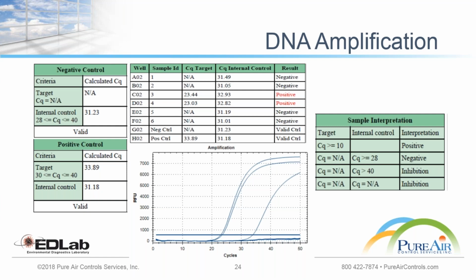Yeah, and I know that here in our laboratory, Dr. Sahay, we do perform all three of these different methods that you just went over. And it's pretty impressive to see the way the technology has evolved over time, especially for this DNA amplification, using PCR, the polymerase chain reaction. You can get these different types of results for whatever your need might be. And once you get those results, the laboratory obtained data, how can it be used in response to a Legionella outbreak?